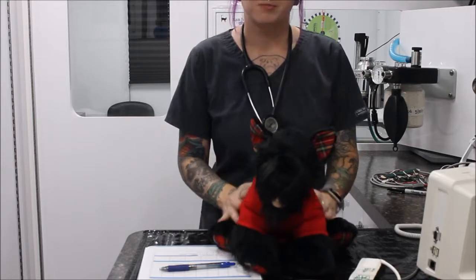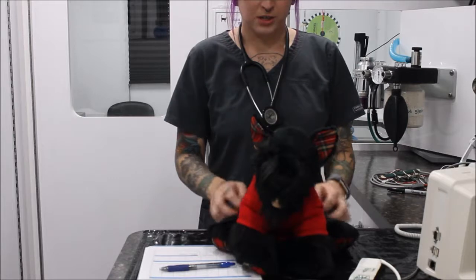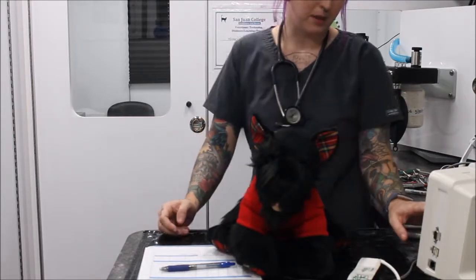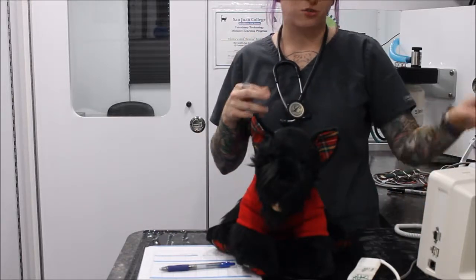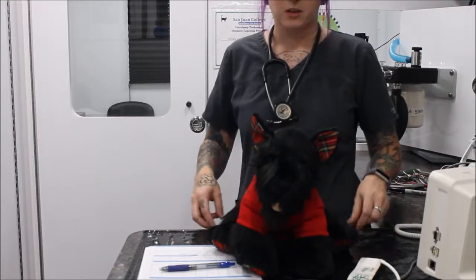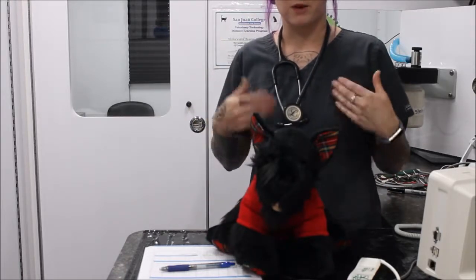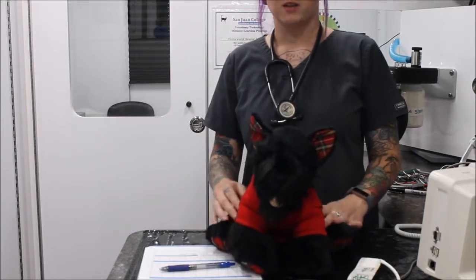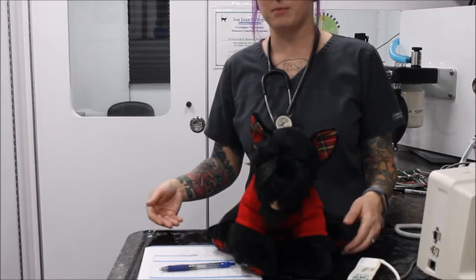And then respiratory pattern is another one we like to monitor. You can monitor the respiratory pattern with your capnograph, and watch for any kind of changes or trends. You want to see a nice smooth pattern, nice deep, regular breaths. You don't want anything that's really too sporadic. You don't want them panting. Sometimes that can indicate that they're not in the correct plane of anesthesia that you need before you start surgery, so they might be too light.